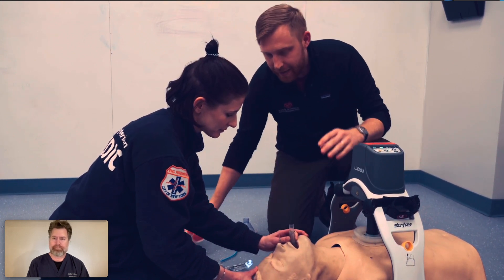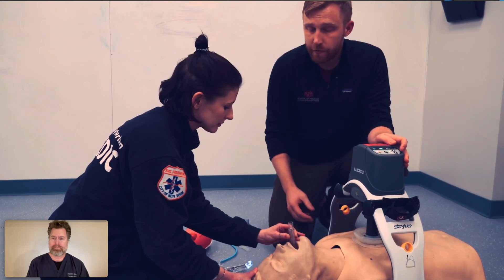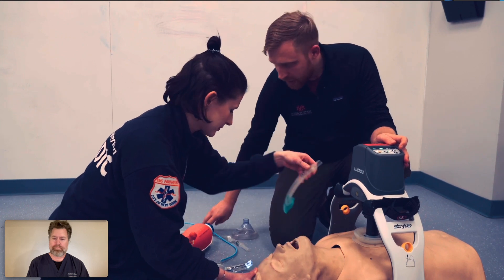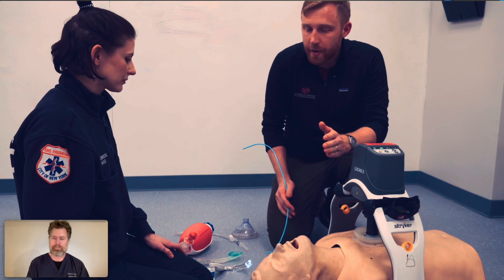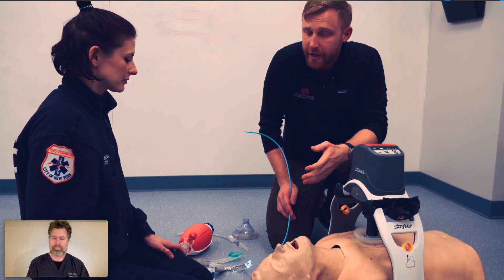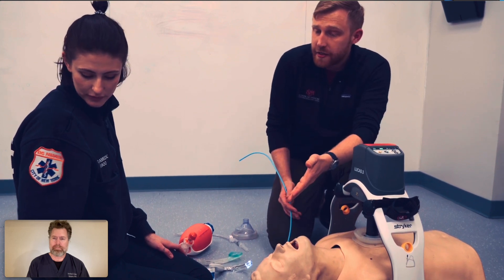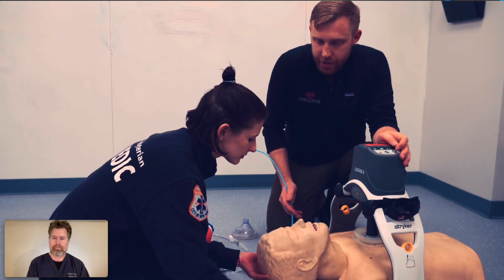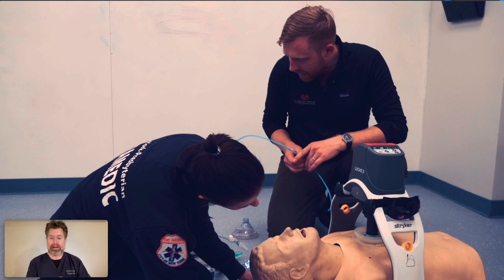Let's say we can't ventilate adequately, or we're far enough into the arrest that we need to exchange for an endotracheal tube. Pull the supraglottic airway and intubate with chest compressions ongoing. The most important thing is maintaining chest compressions without interruption. One way to maximize your chance of success is positioning the patient — use the sheets to get the patient's head into a more ear-to-sternal notch position.